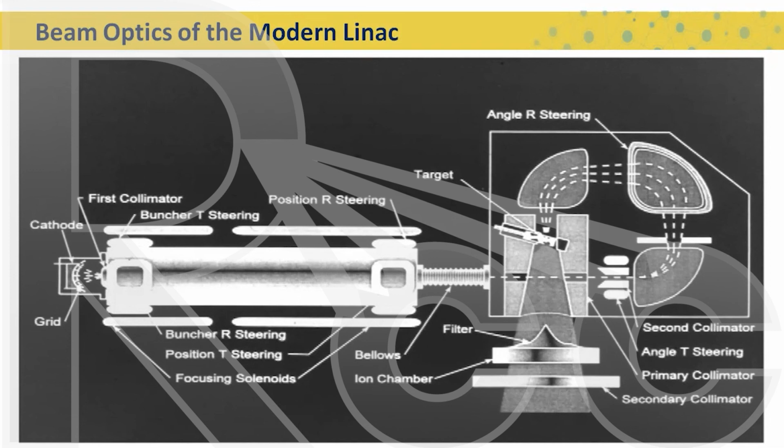All right, great. And our final question, Timom asks, why do we use cobalt beam quality over Linac during calibrations of the dosimeters? Because that's a very, very good physics dosimetric question. Cobalt 60 is nature. It is made in a nuclear reactor, by the bombardment of stable cobalt 59, it becomes cobalt 60, highly radioactive. The energy of the isotope is precise.